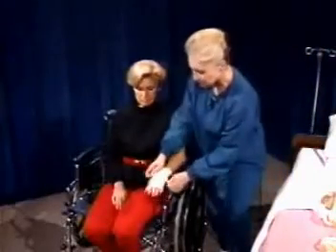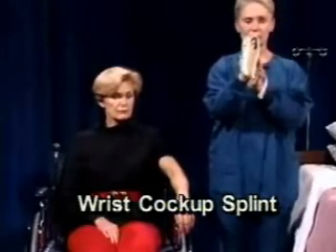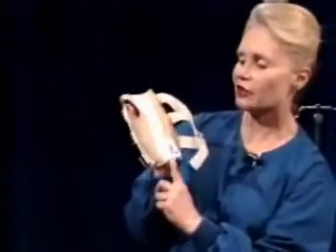And I'm going to remove the stockinette because next we're going to look at a soft splint. This is called a wrist cock-up splint. I'm going to turn it slowly so you can see that there's a series of D-rings, metal D-rings on this type. And as I turn, there's an accordion-like type of fabric material. I'll get my hand out of there and then put it back in so you can see that it expands and contracts. So this will be able to be fit on virtually any patient's hand, but these do run small, medium, and large too, and that's a help. On the back also, which you cannot see, but you can kind of see the coloration is different, is a hard, rigid bar. Once in a while, that bar will slip right through here at where my finger is, and it should be pushed back up in there and anchored. I've seen more than one patient come to therapy with the bar sticking partially out. It's adhered to the arm with a series of Velcro closures, so we're going to show that.